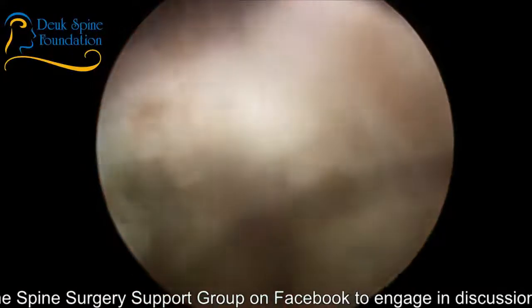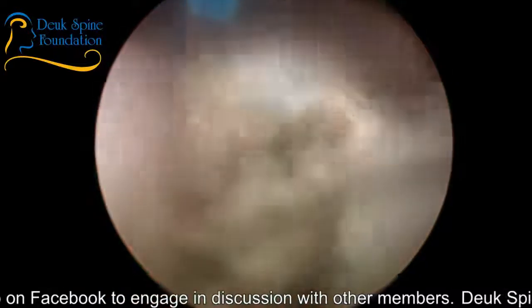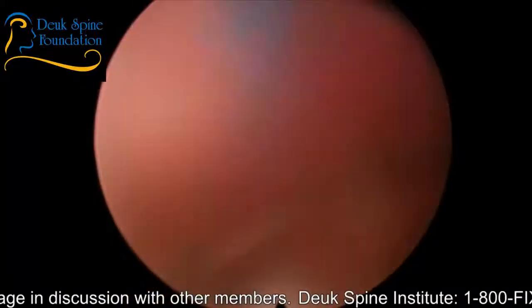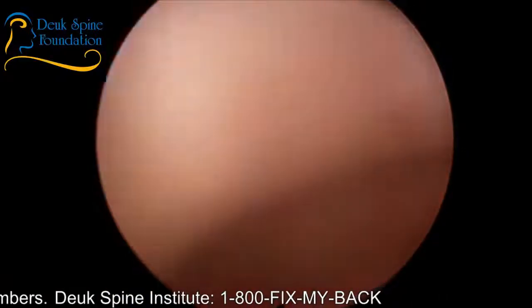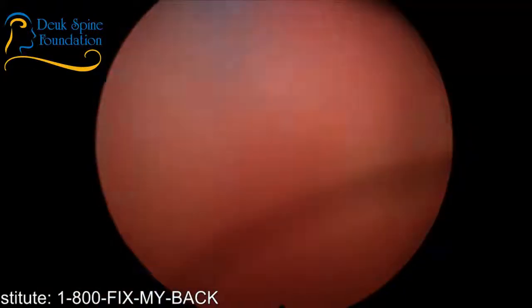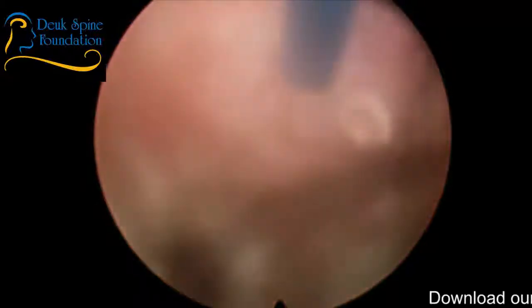Sorry it's not a better view for you all, but the patient's had a lot of inflammation. He's got a lot of inflammatory changes that involve blood vessels kind of growing into the end plates and around the herniation, as those are just bleeding. That's typical. The more inflamed something is, the more bleeding it's going to have associated with it. So hopefully when I'm done, this thing will start healing and his symptoms will go away. That's what I expect. Because of all the inflammation, it's going to take some time to completely heal. But it will heal.